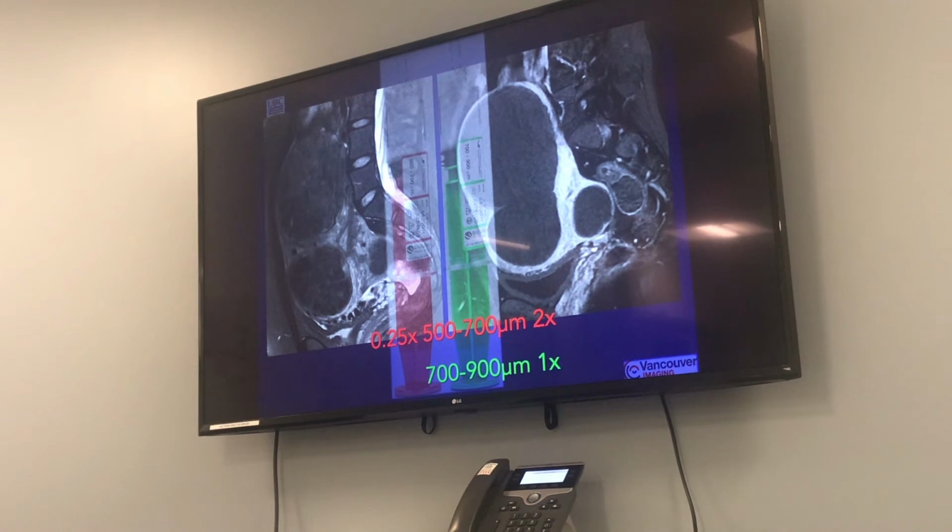So in many patients, you will not see a significant shrinkage of the fibroids, but for most of the patients, we don't do them because they have big fibroids, we do it because they bleed. So many of these patients won't have a huge decrease in size of the fibroids. We do this mainly for bleeding. Sometimes we can shrink the fibroids, but that's not really what we're doing it for. So if patients come to us and they don't have a lot of bleeding symptoms, but they have bulk symptoms, this is not the procedure for them.